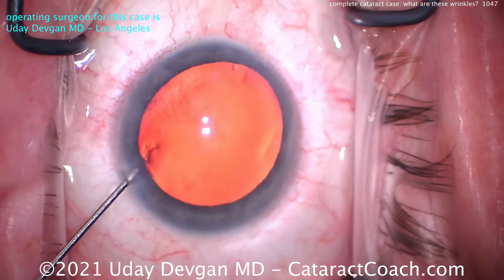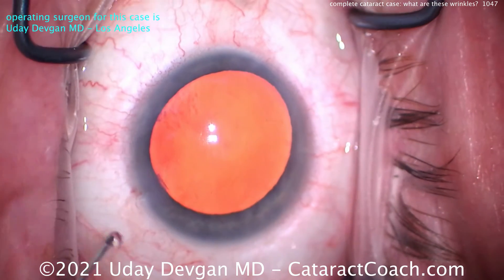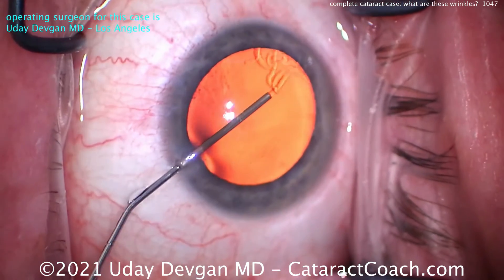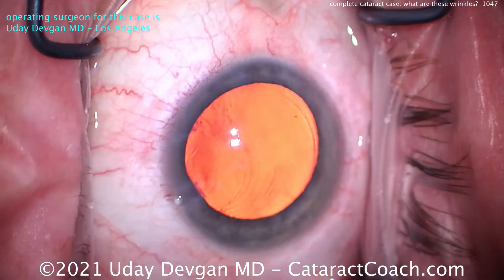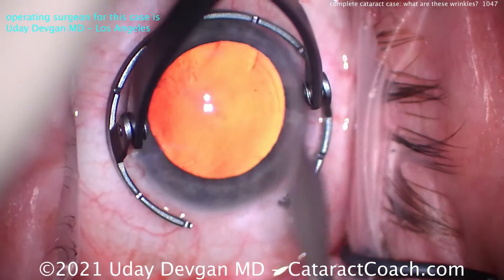Now topical tetracaine on the cornea, and that was preservative-free lidocaine going into the anterior chamber, cut with balanced salt solution. Here comes the dispersive viscoelastic injecting to fill up the anterior chamber. Watch carefully — the anterior capsule looks pretty normal, looks like a normal case. Let's put the fixation ring down.